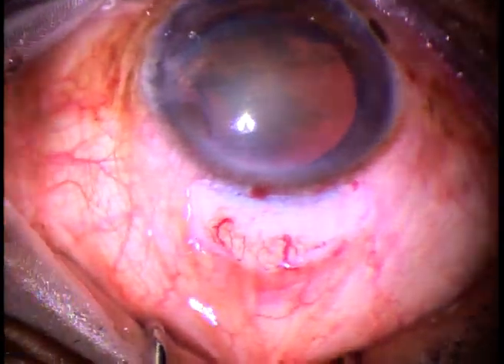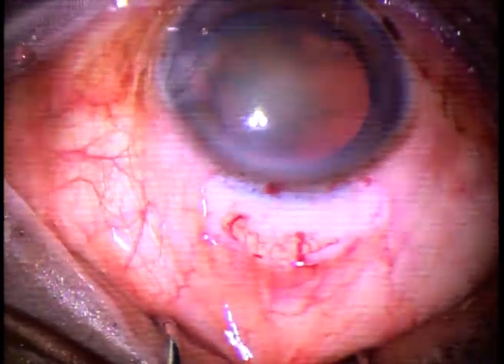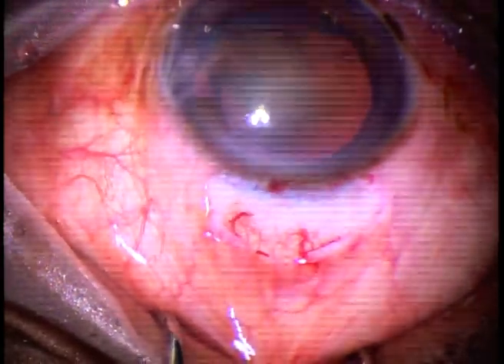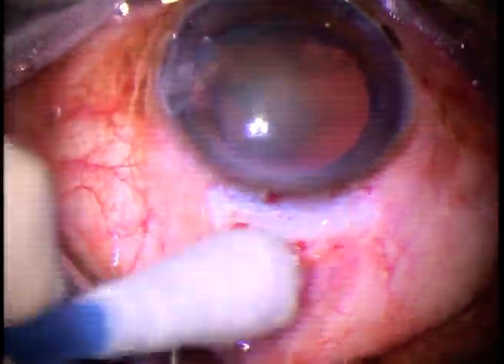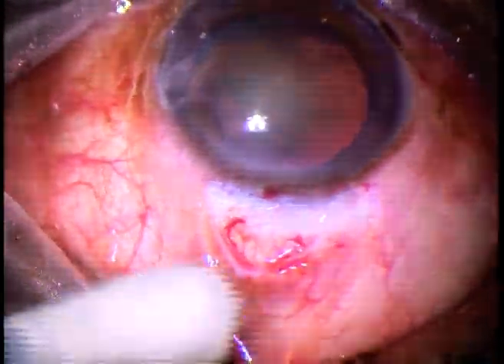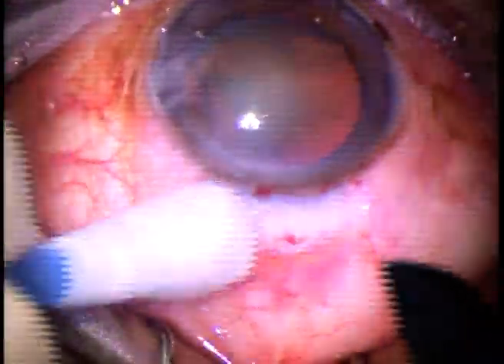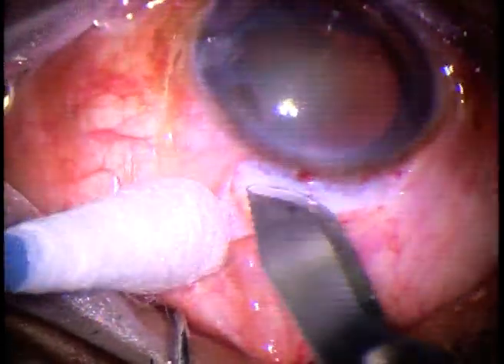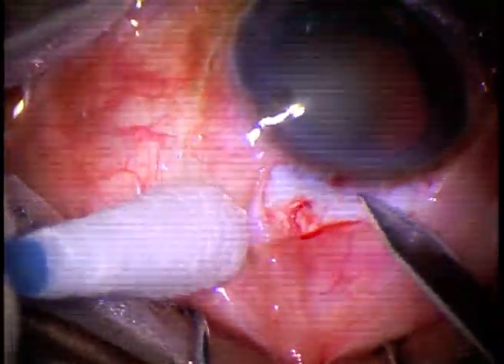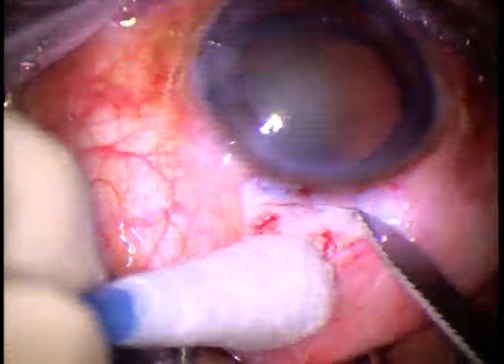Now the incision. A 15 number Bird Parker blade is taken and the incision is placed from one o'clock to eleven o'clock. This is a frown incision.